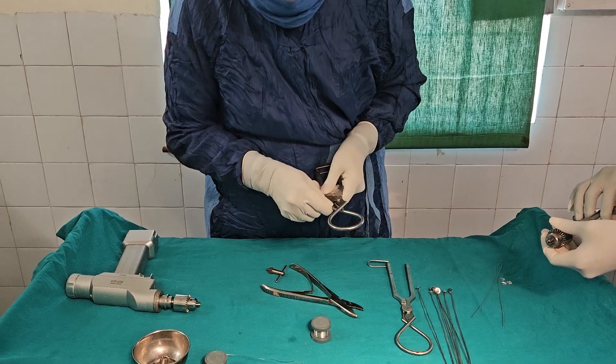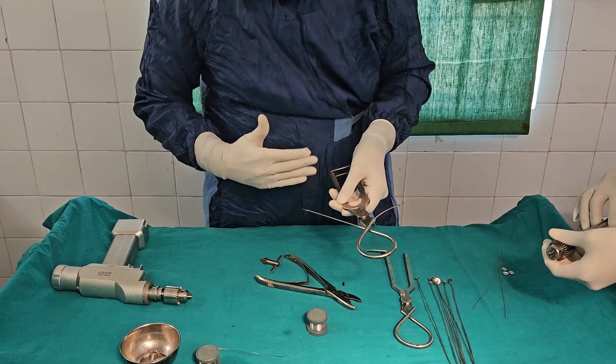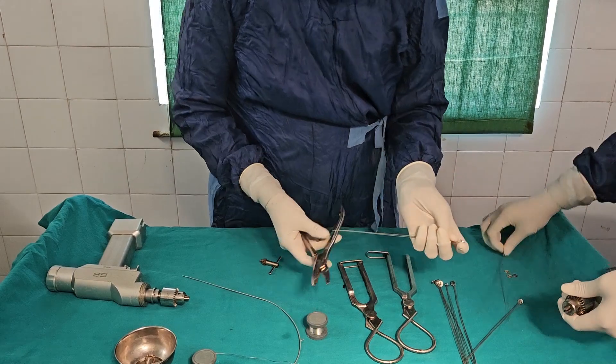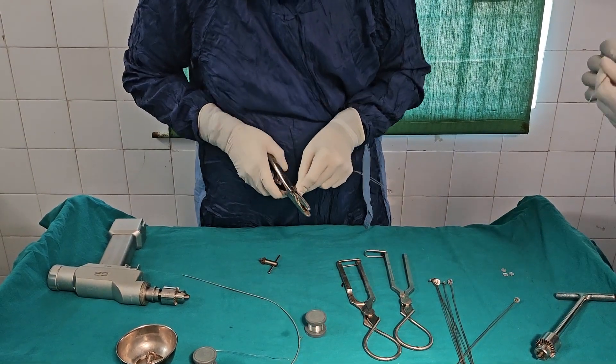Sometimes this cable length may not be sufficient to pass inside because of the depth of the wound. So in such cases, what I normally do is I take the drum and wire.